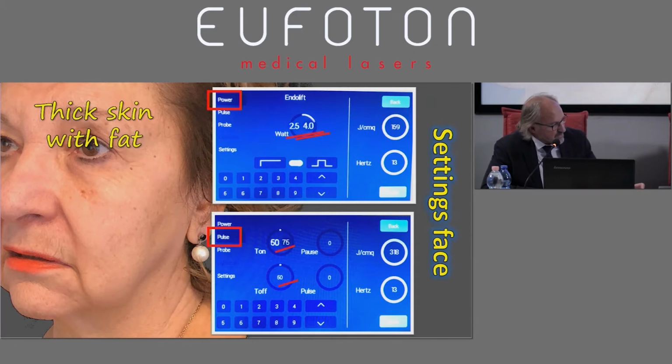I do not believe it's just the patient's response that counts, but also whether the tissue is more or less fibrotic, the adipose lobules and adipocytes. We have many things to take into account to be more accurate when setting the machine. 170, 200 joules for the beginning, but not more than 400 and 500 joules for one single side.